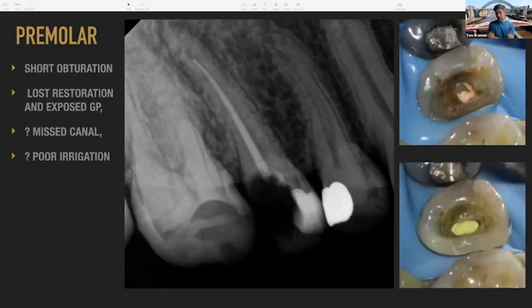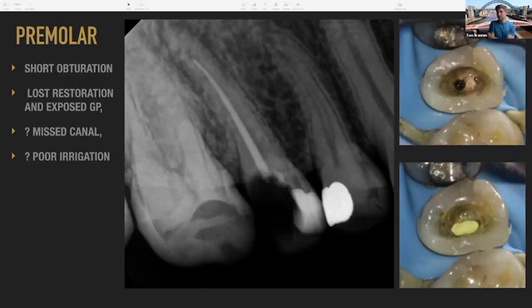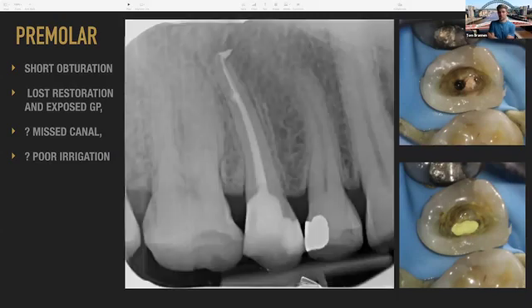And then here we can see there's a composite wall distally that was built up, and that's just some calcium hydroxide dressing in the tooth. I think that was all we did at the first visit. And then the second visit, we've managed to clean. I think there are 2 canals there. I think that's what some of the GP we've removed is in that top one.